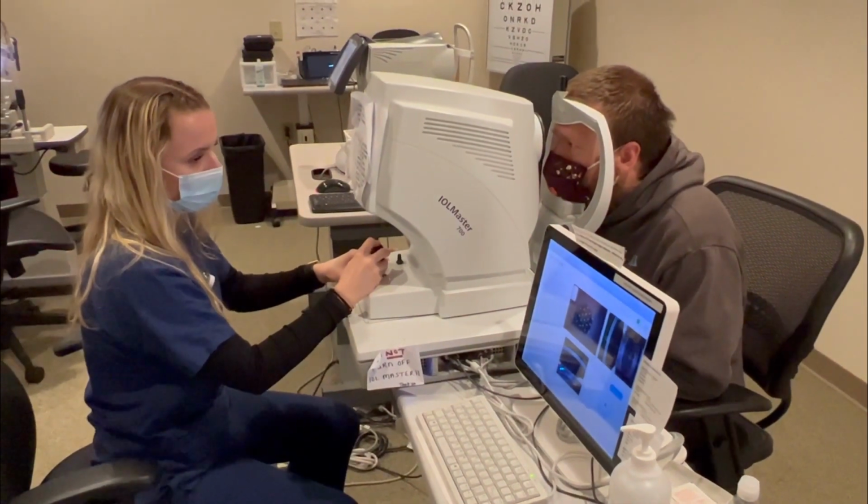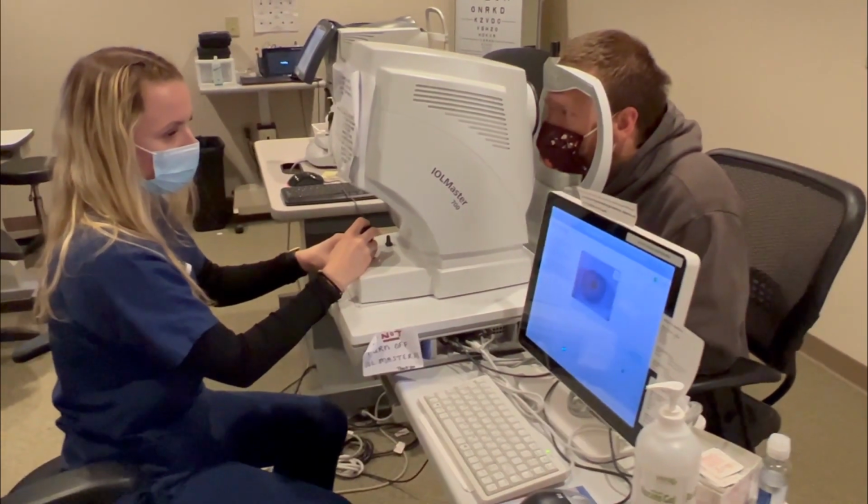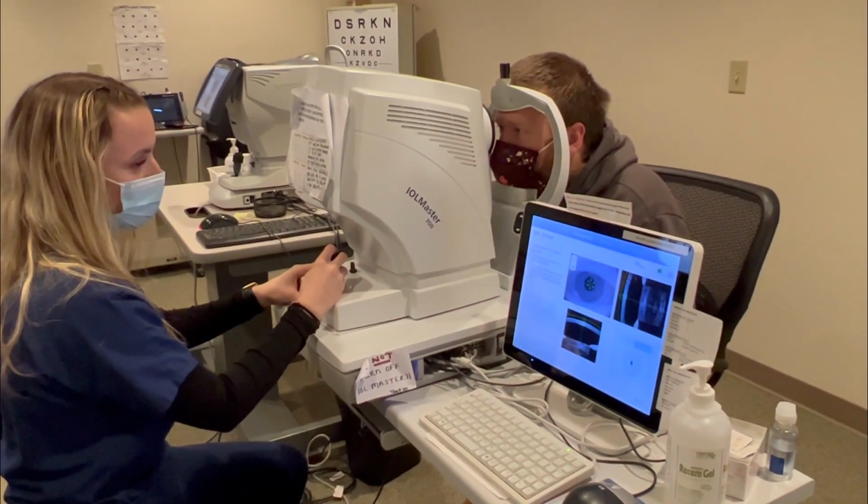Now, the IOL Master does take a picture of the eye, and it registers that picture in Veracity, and it registers the steep axis off of the image. So now there is more than one way that that data can be used. Some of the new lasers will actually use IOL Master data to register the steep axis using image guidance to show the steep axis or make marks on the steep axis during femtosecond laser cataract surgery.